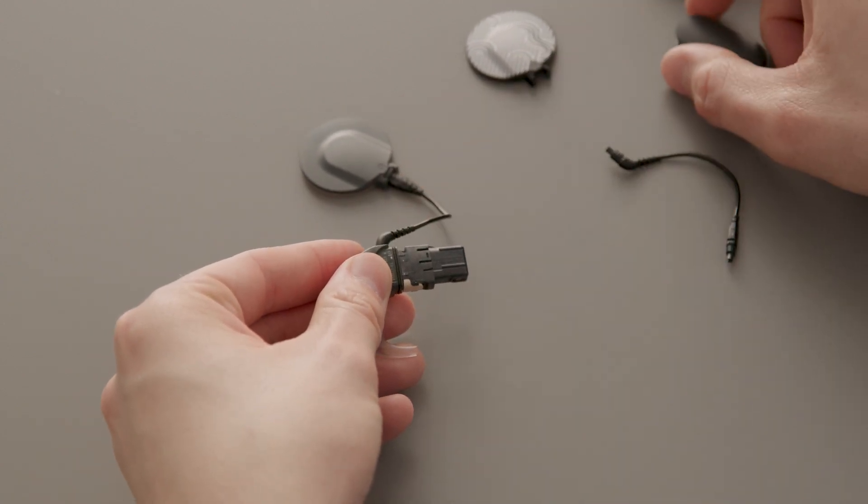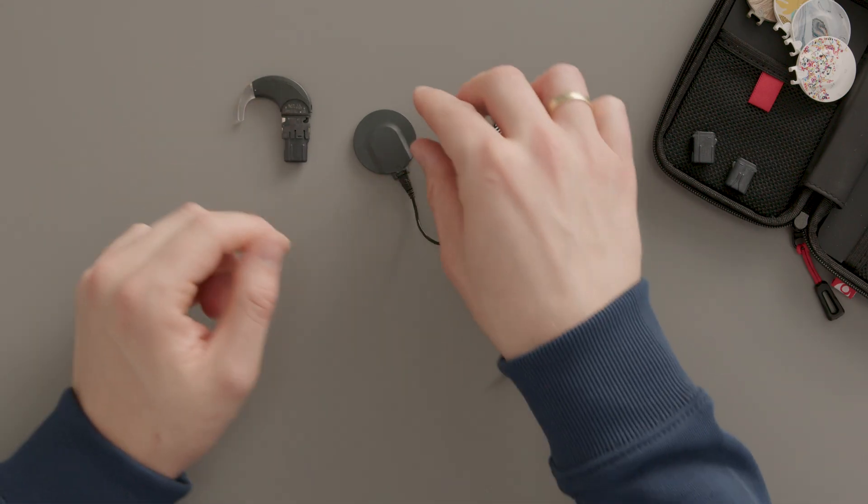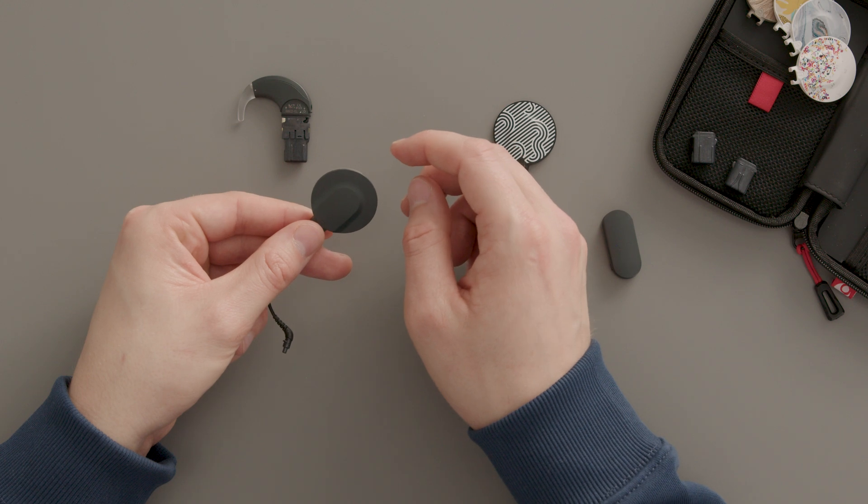Gently pull the cable out of the socket. To detach the cable from the coil, first remove the coil cover. Hold the socket between your thumb and index finger.